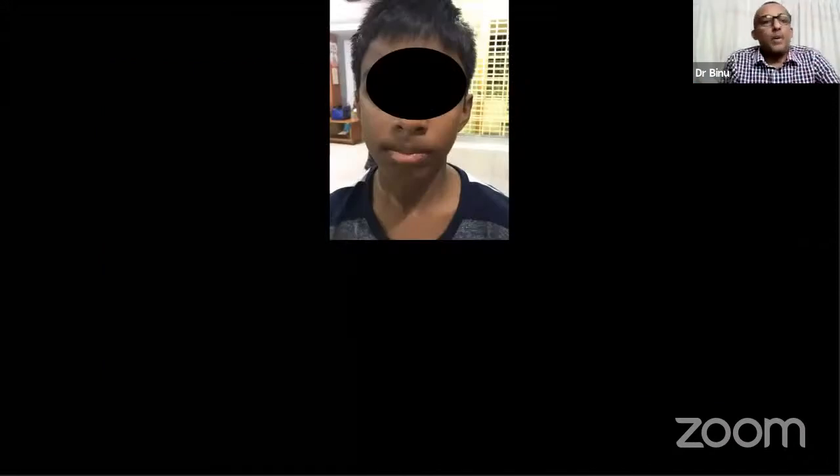Frontal view. Look at that. What a nice Venetian blind behind and the wooden cupboard work behind. Why can't you do that simple effort of asking the patient to stand in front of a plain wall? Do you need a digital SLR for that? You don't need it. All you need is attitude.